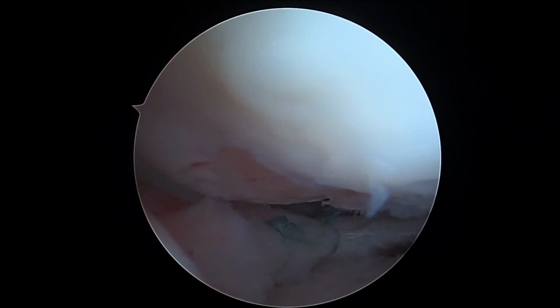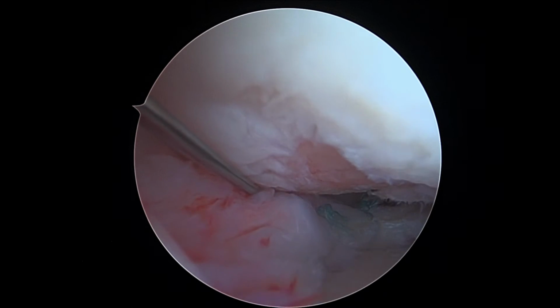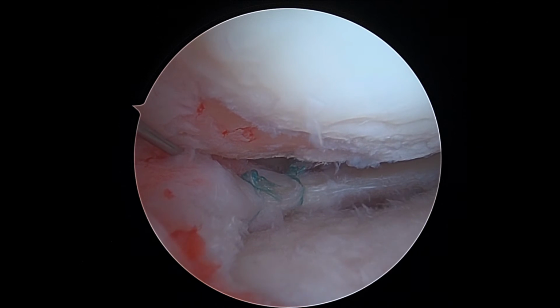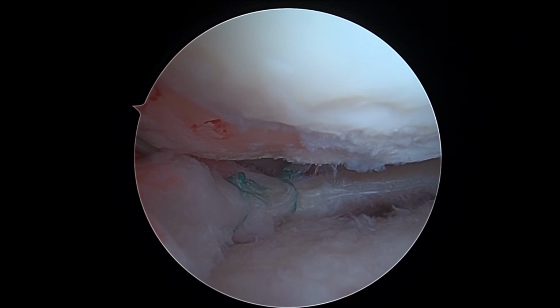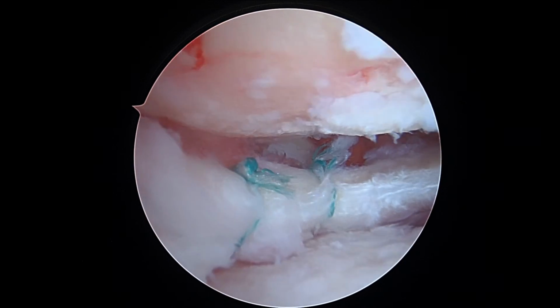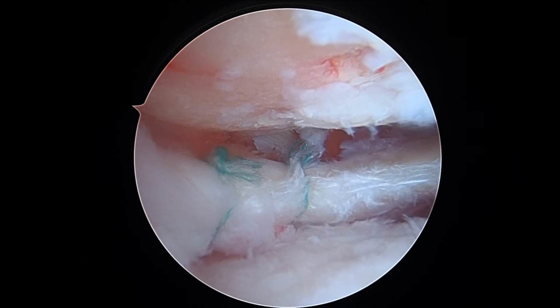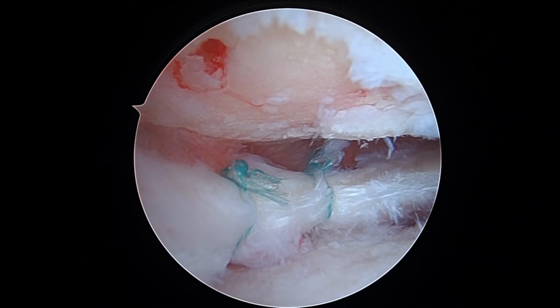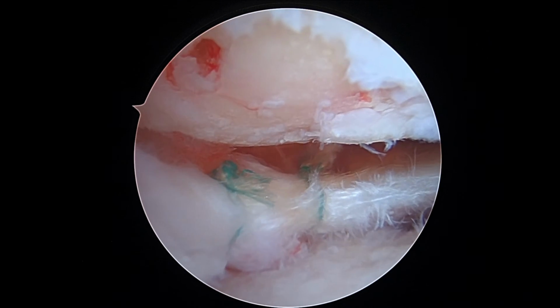Okay, here you go. So what we're showing you here is we've got the needle in at the meniscocapsular junction to inject our PRP. We've turned down the pump pressure a little bit. And although you can't see it unless you look really closely, we're actually injecting right now. You can see those tissues start to fluff up behind the meniscus there. And that's actually some of the PRP, so we know that we've got that pretty full up.